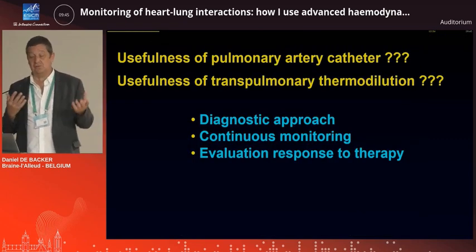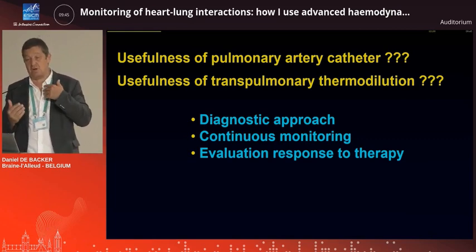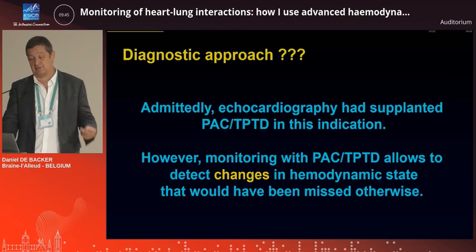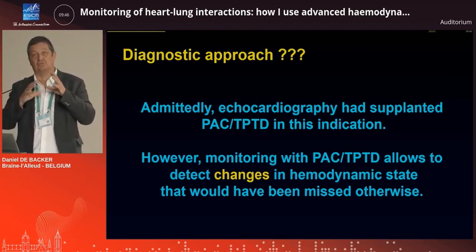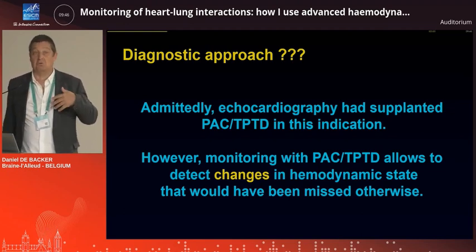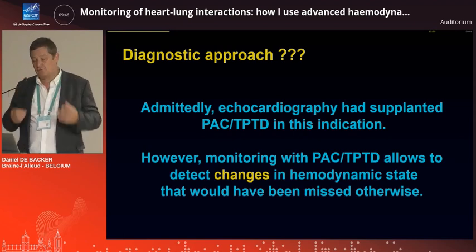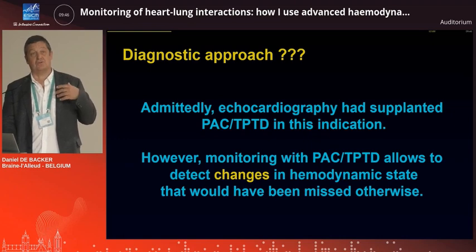So the usefulness of these two techniques is perhaps in the diagnostic approach, but probably much more in the continuous monitoring and evaluation of response to therapy, and I will discuss this. Because with the echo, really, we have the gold standard to make our fine-tuned diagnosis, and when we have left heart dysfunction, we can know exactly what is the problem. Is it the pump? Is it the valve? Is it the combination? We have a very good diagnostic tool, but again, changes over time may be a little bit more complicated.